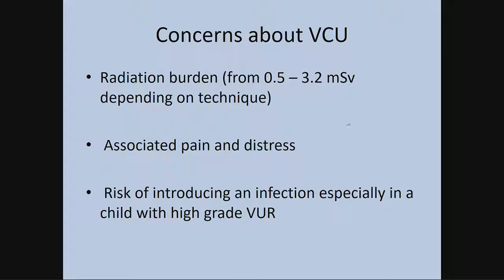Now, the concern about cystogram is the radiation burden involved. The actual dose the kid gets depends on the technique used. There is associated pain and distress, and there is a risk of introducing an infection, especially in a child with high-grade reflux.